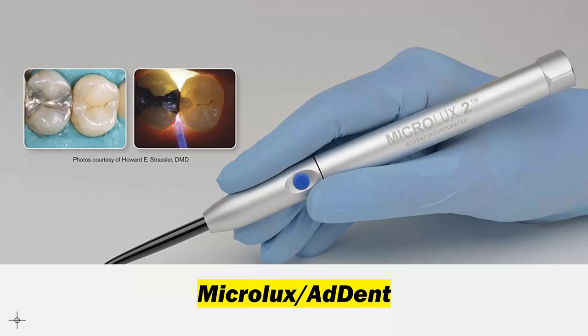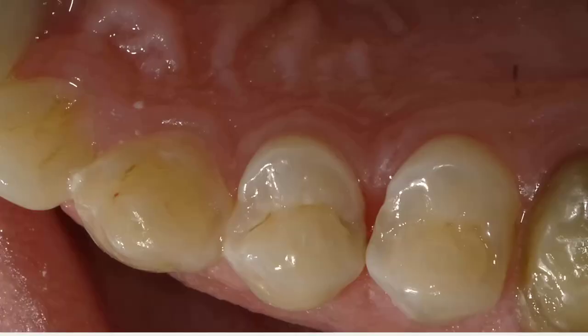Now I'm going to take you back to what you have to understand: the tissue here is very high. If in fact there is something here, when I drop that box, I'm going to be sub-G. And I've got to be able to now tell that patient that you might need a gum procedure. I'm not going to say gingivectomy because they don't know what a gingivectomy is, but you might need a gum procedure to modify the level of the gum so I can fix your filling.